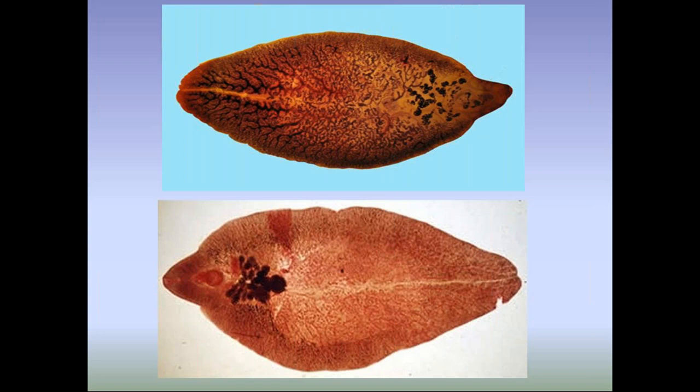The larval form is also there. In Taenia solium and Taenia saginata, the larval forms are Cysticercus cellulosae and Cysticercus bovis in tapeworms. But here, the metacercarial larva is the infective form, and the other larval forms are miracidium, redia type 1, redia type 2, and sporocyst, etc., present in the case of Fasciola hepatica.